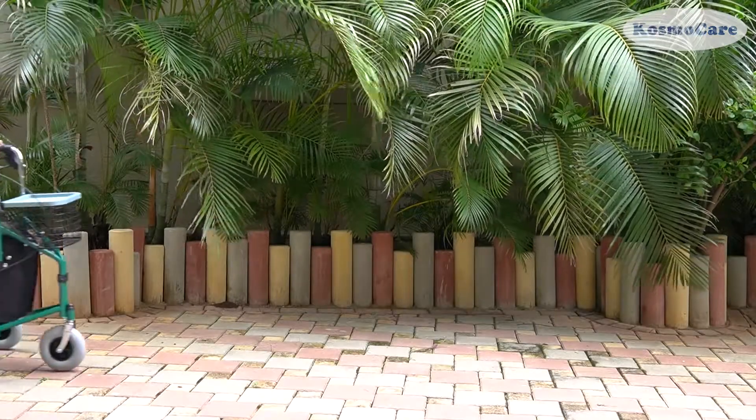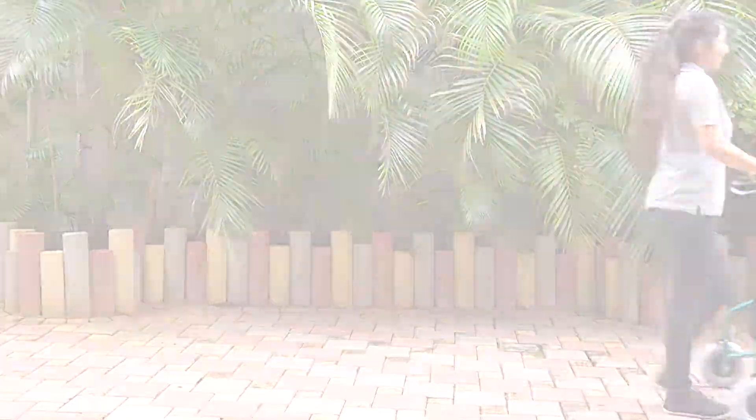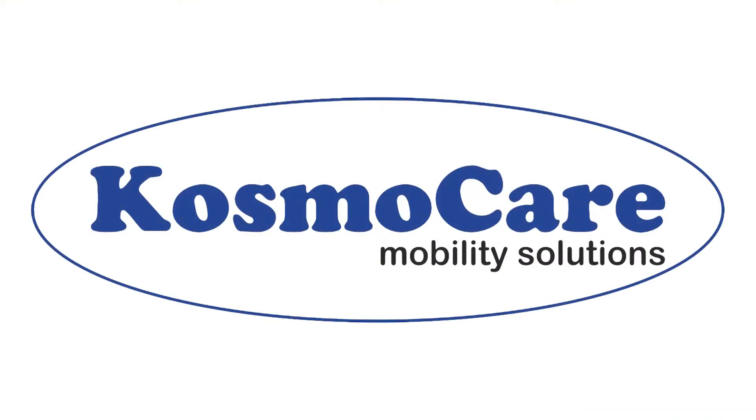So, help your loved ones to walk independently and give them the confidence and stability they need wherever they go, with the Tri-Veal Rollator Walker with Tray, from CosmoCare.